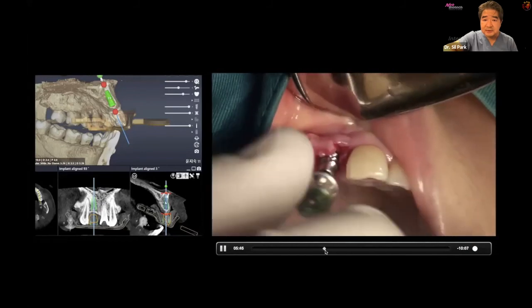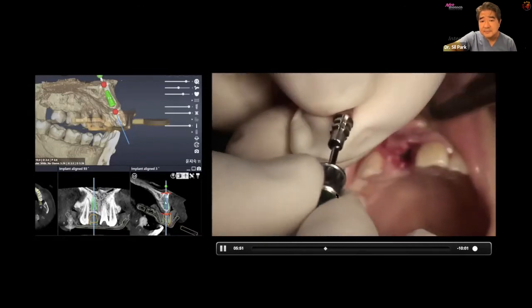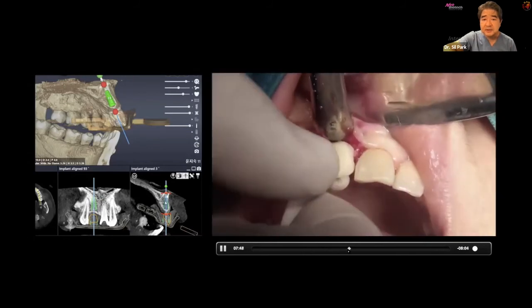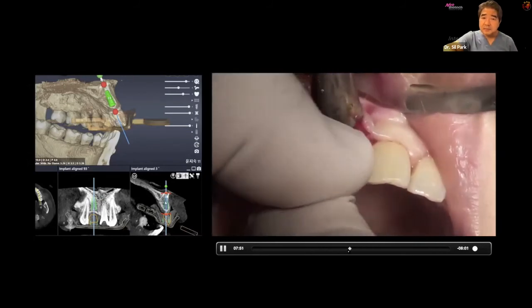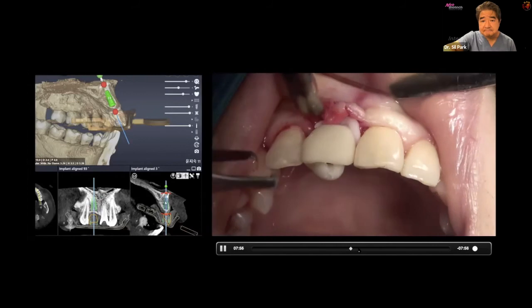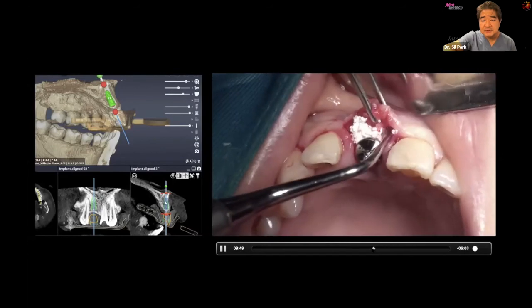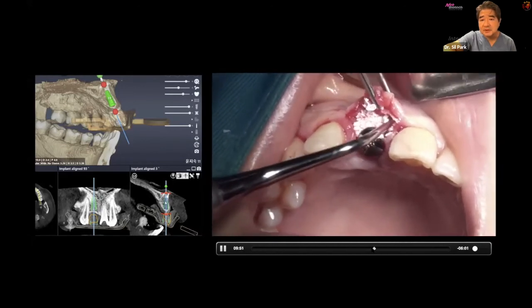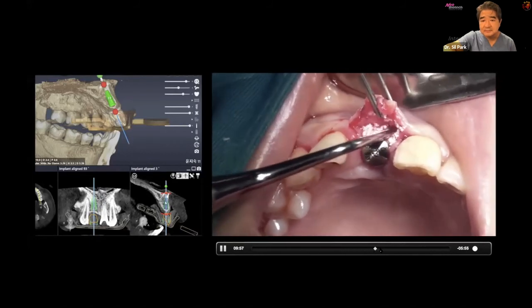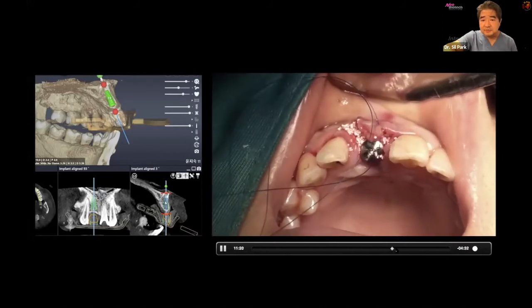Let me go in. So now this is the abutment, temporary screw, and the one screw is done. Let me just jump ahead, and then we are using those temporary screw cylinders to create the temporary prosthesis over here, right? Okay, so once the temporary prosthesis is done, we put the healing abutment and put some bone graft on the buccal aspect of it with the healing abutment in it. And then once the bone graft is ready, we're suturing.